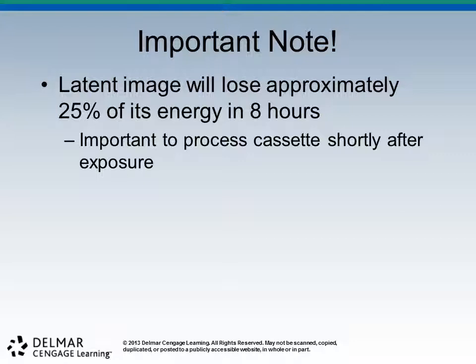An experiment we ought to do is to make an exposure, label that appropriately, park it somewhere for a couple of days, and then scan it and take a look at it. One of y'all do that.